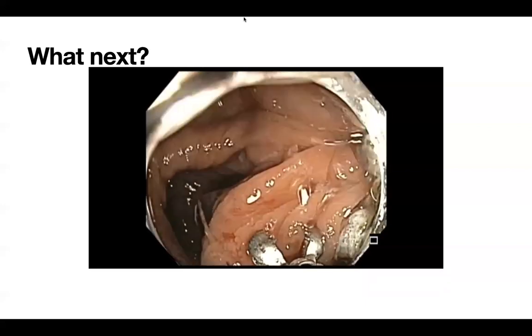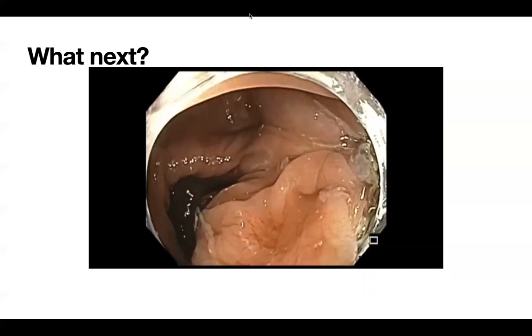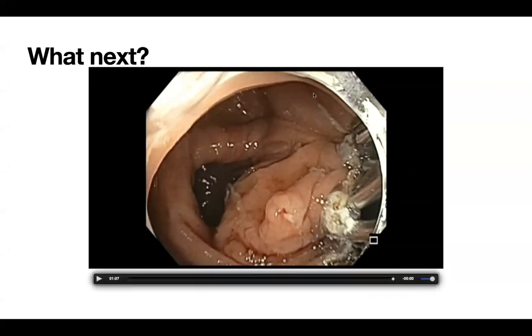One advantage you can see in this case is your cap is actually pushing your clips down and makes an area that is a little bit difficult to access easier to access. And as you can see, that's actually one of the big advantages of a cap. You have the cap, you have the clips, and the cap is pressing on those clips to bring that area of interest towards you.